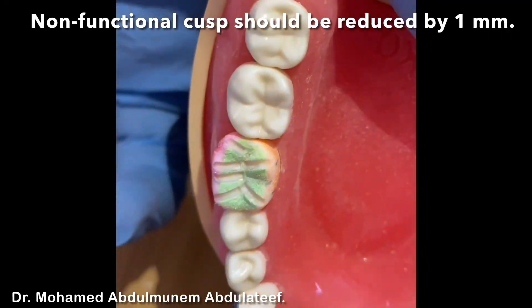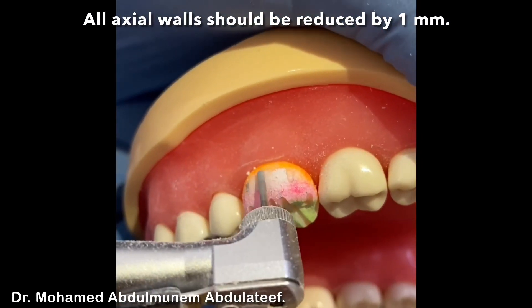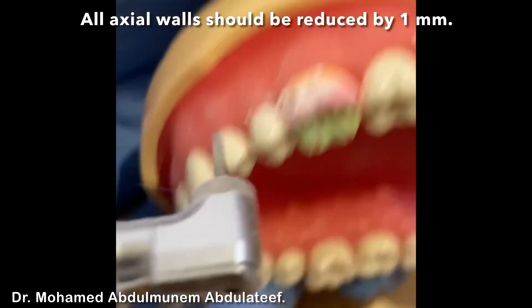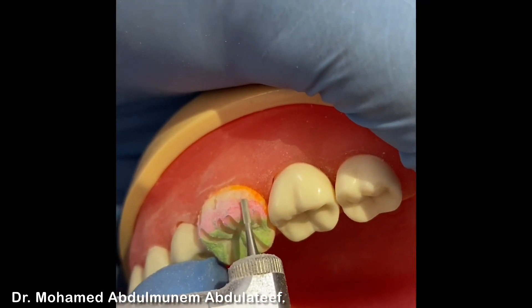Now the grooves are ready. I also do the mesial one. The buccal surface — we'll do the two-plane reduction. So here also for several planes.